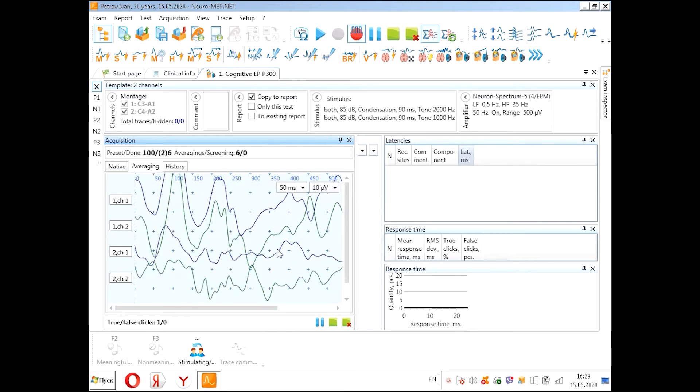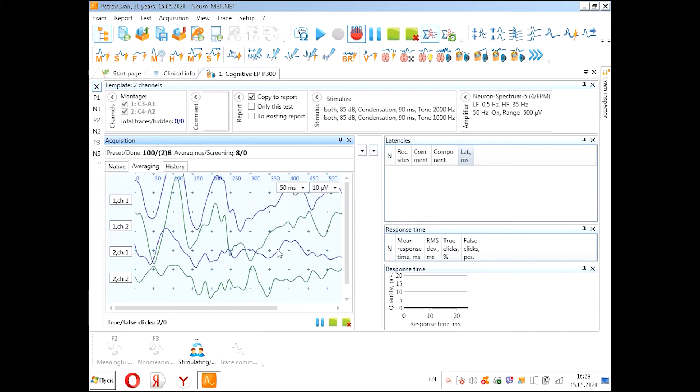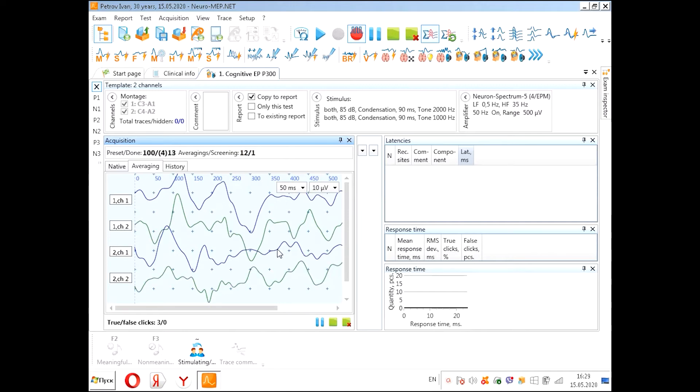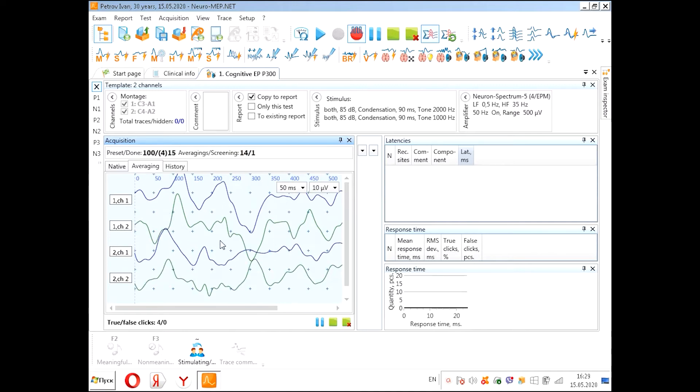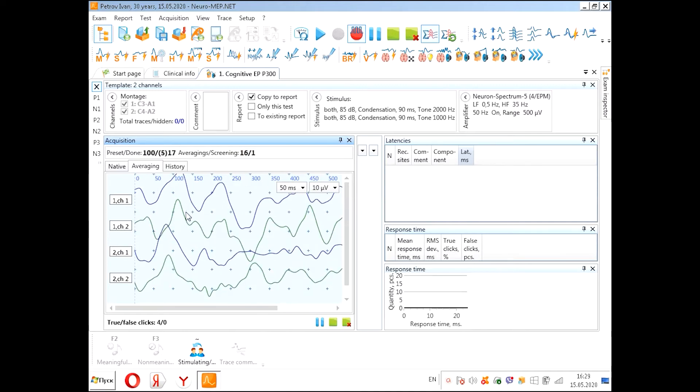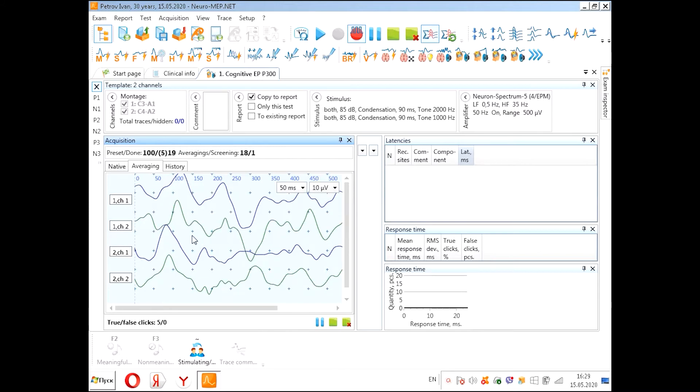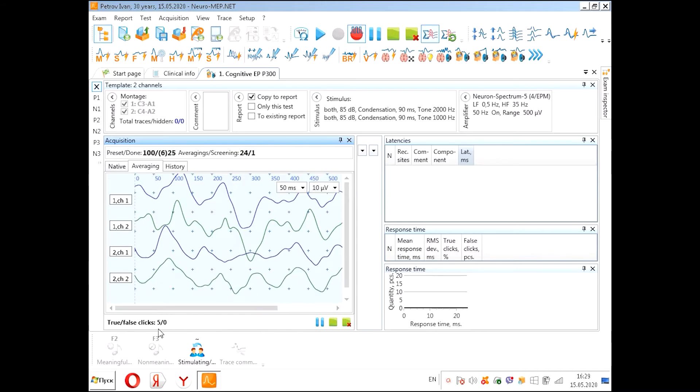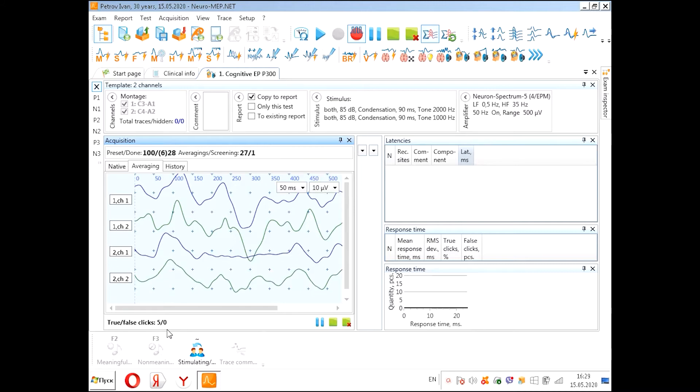We see curves. Two curves for one channel and two curves for the second channel. These curves are for meaningful stimuli, and these curves are for non-meaningful stimuli.